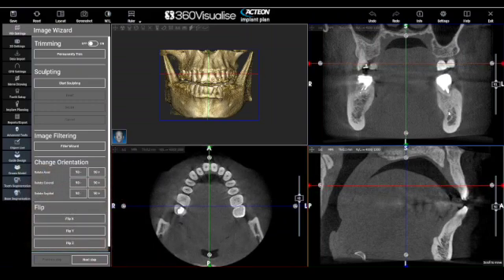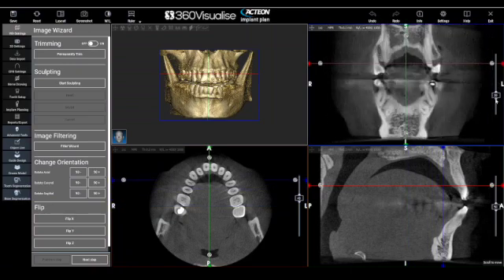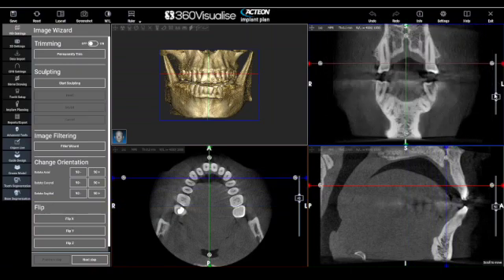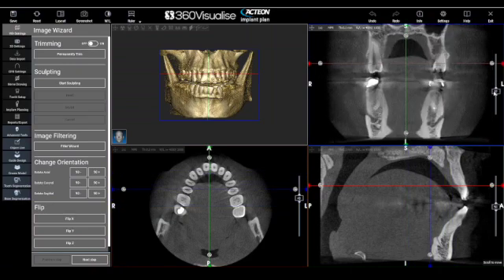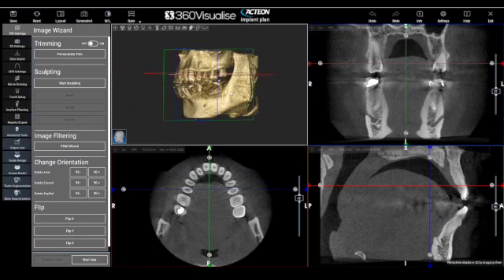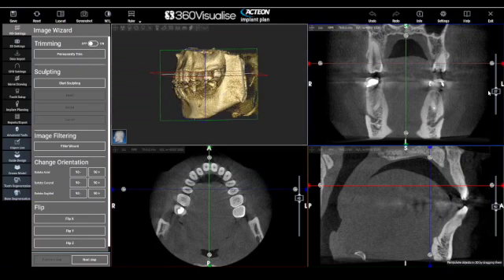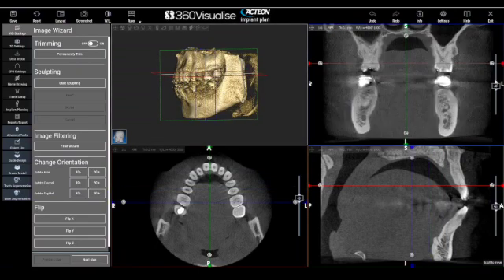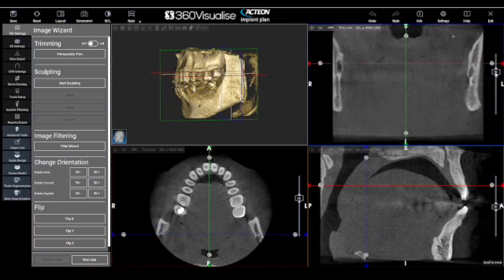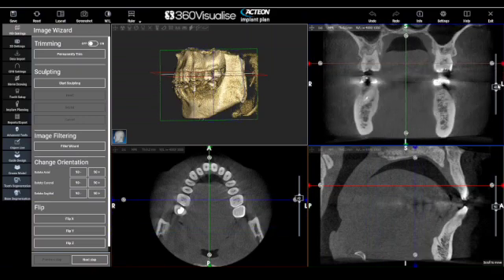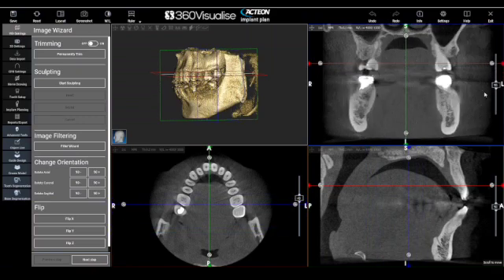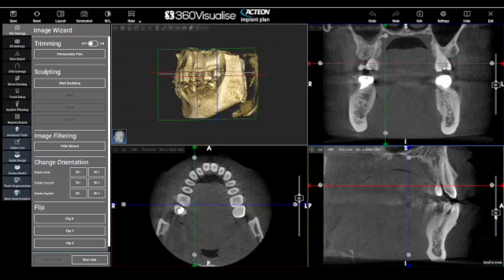We can do the same on the coronal view. This is represented by the blue line, which you can see moves when I drag the slider. The green line represents the sagittal view.